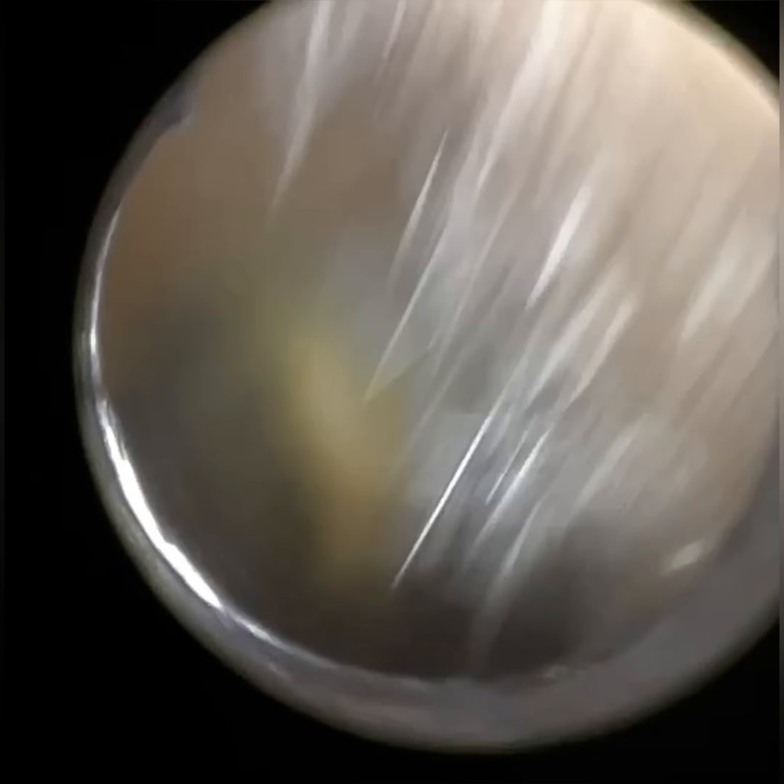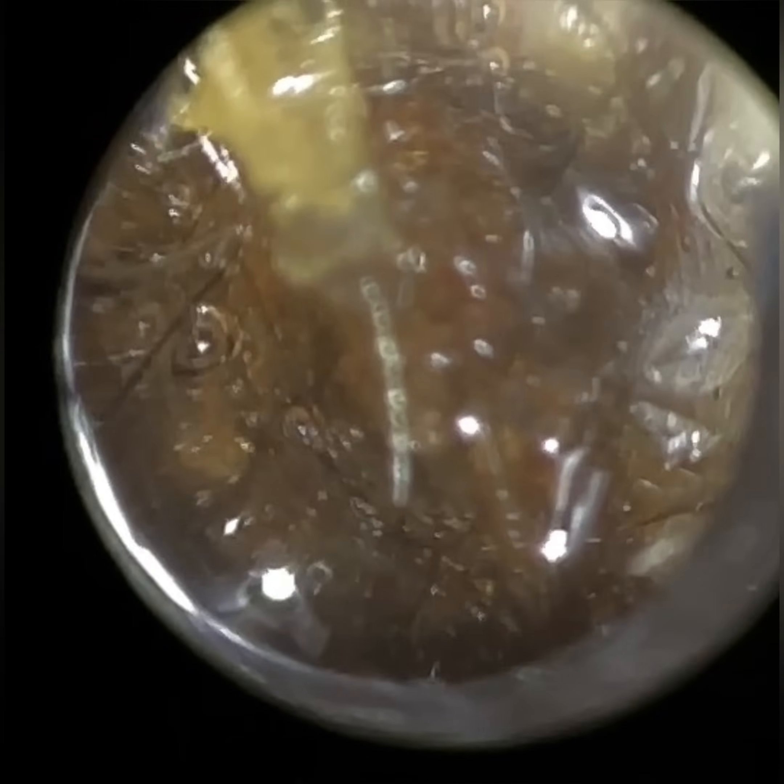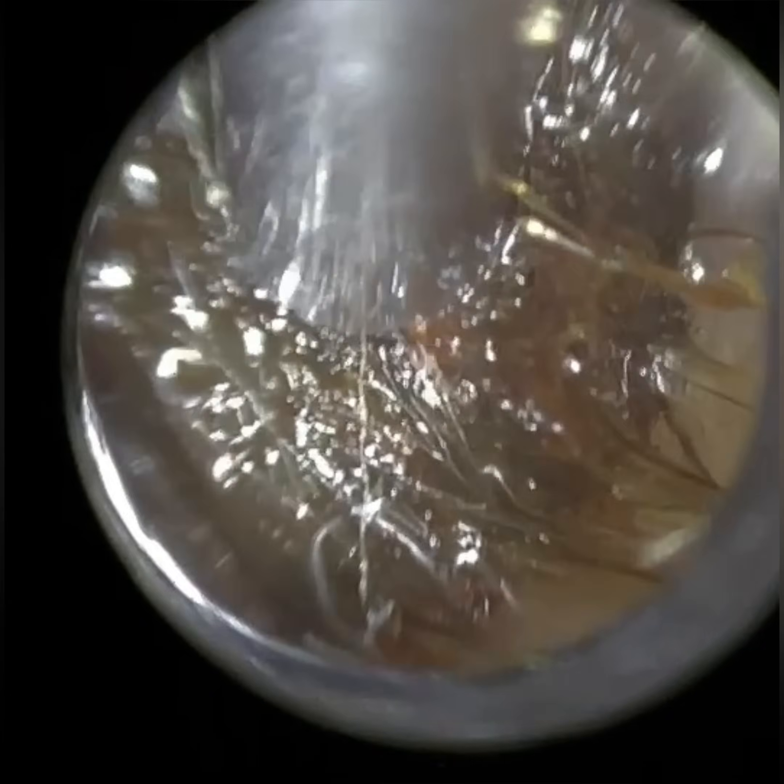We'll see how that goes. You can also adjust the exposure — if you want more brightness, it's a single swipe of the finger on the app. I don't really feel the need to do that much with the Waxscope, truth be told. Once you've got the exposure set, it shouldn't really need to be adjusted.